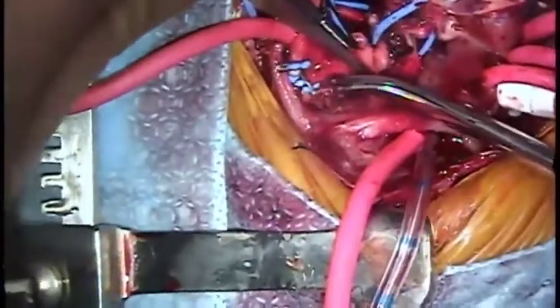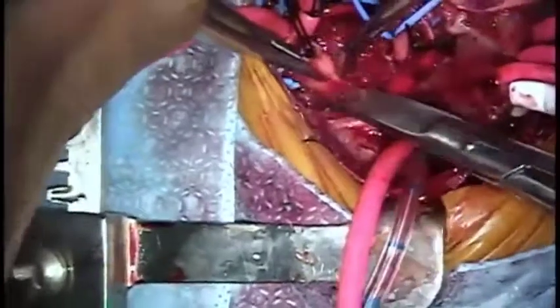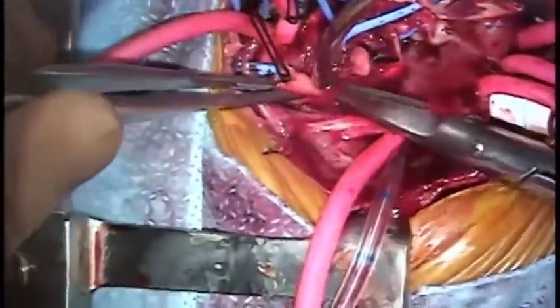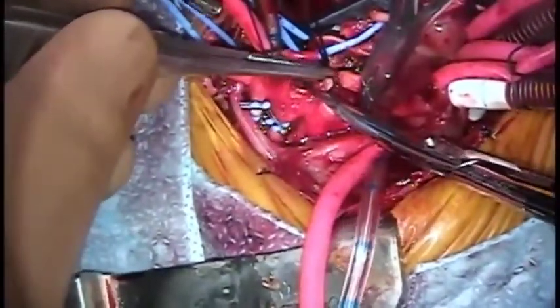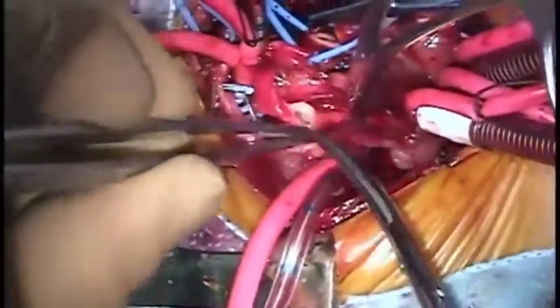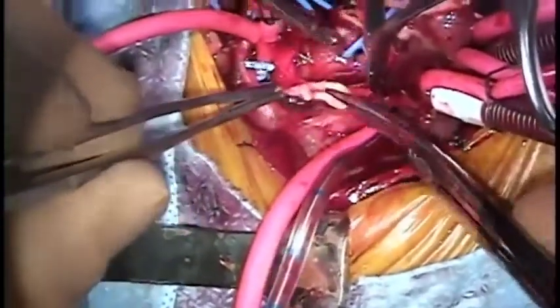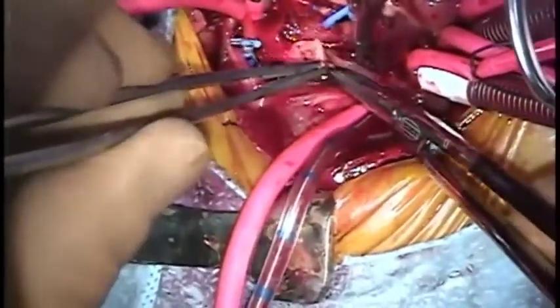Further mobilisation of the aortic arch is carried out, taking care to avoid damaging the right recurrent laryngeal nerve or any mediastinal branches of the descending aorta. A side-biting clamp is applied to the descending aorta and the ductal tissue is completely excised. The gelatinous consistency of the ductal tissue can be clearly seen here.